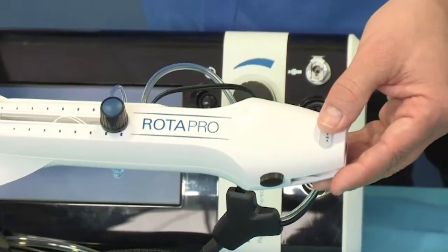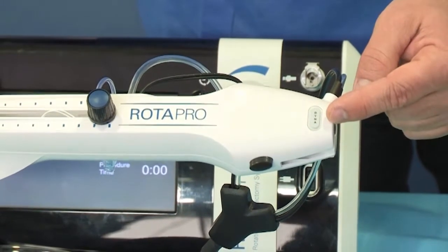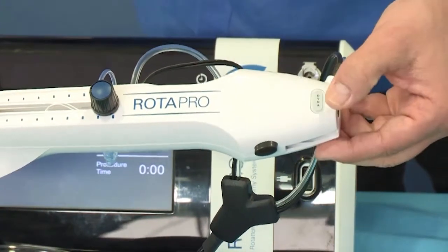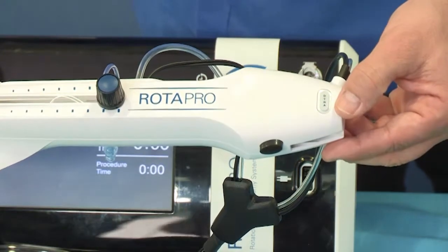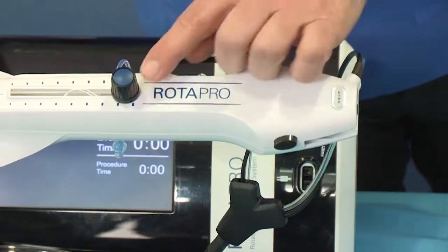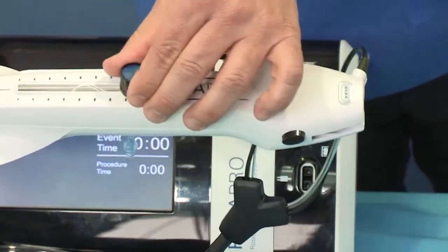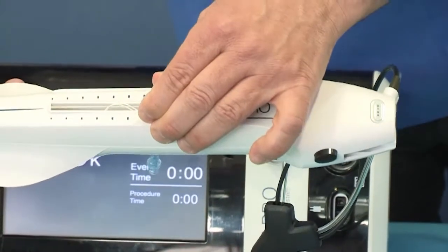How do we move from rotablator mode to Dynaglide mode? Well, there is this new function now on the advancer, this button here, that if clicked will switch from rotablator mode to Dynaglide mode. If we are in rotablator mode, by pushing on this button we will activate the rotor and we can perform our run of rotablation.